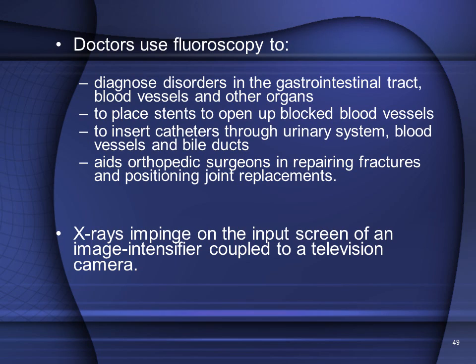Basically, X-rays impinge on the input screen of an image intensifier, and this intensifier is coupled to a television camera where you can see live images of the patient's internal organs.